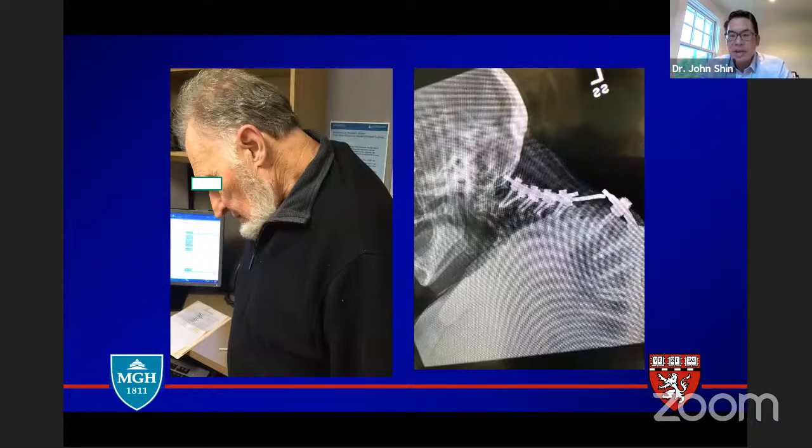And you can see here that the patient has a fracture in their rod. This patient had a cervical thoracic fusion done elsewhere many years ago and presented with severe pain. And you could almost see the rod, the deformity and the distortion poking through or pushing up on the skin.